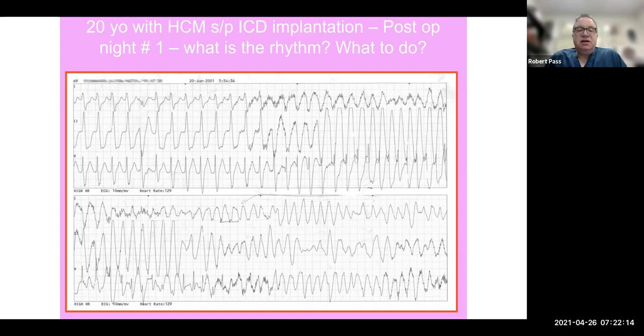Now, at the present time, shortly after this, in the early 2000s, the United States government mandated that all pacemaker and defibrillator leads be so-called IS-1 leads, meaning that they all fit into the same header of any device, meaning that you can mix and match and put a Boston Scientific lead into a Medtronic device and vice versa, or St. Jude, or any company that you like, Biotronik. But at this time in 2001, you still had this problem of lead mismatch.